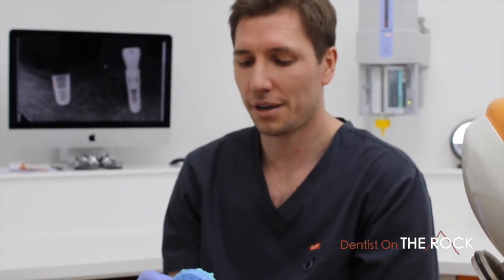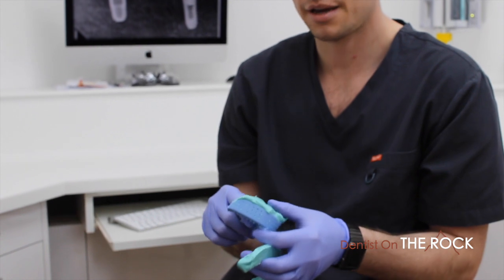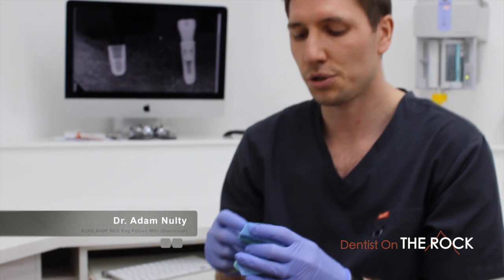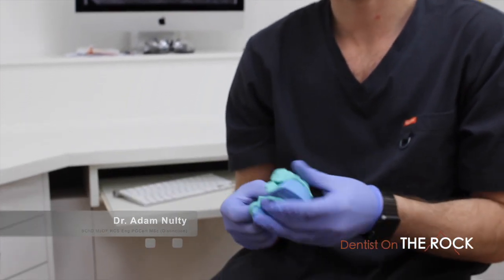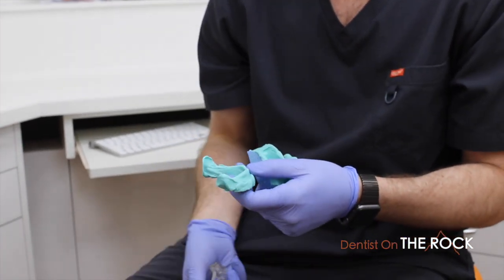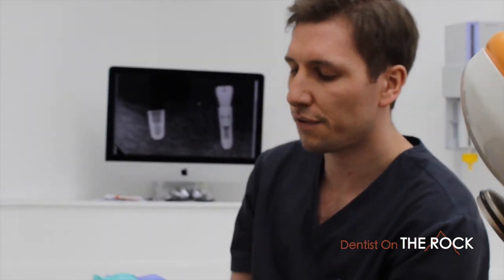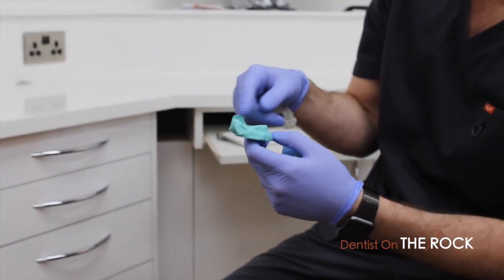I'm going to tell you about a case where the Kodak 8100 3D is an excellent CT scanner — it allows me to think outside the box. With some cases we wouldn't have been able to do what I'm doing here. This case involves a chap who hasn't had teeth or dentures for a few years, and we've ended up doing all-on-four for him.